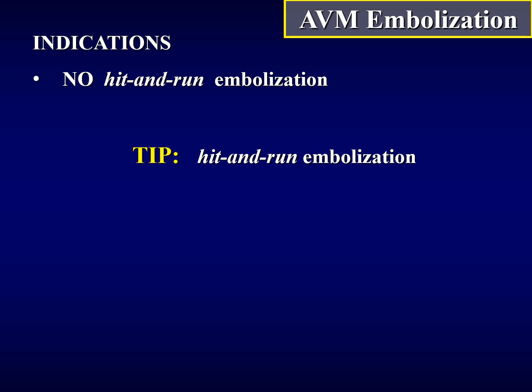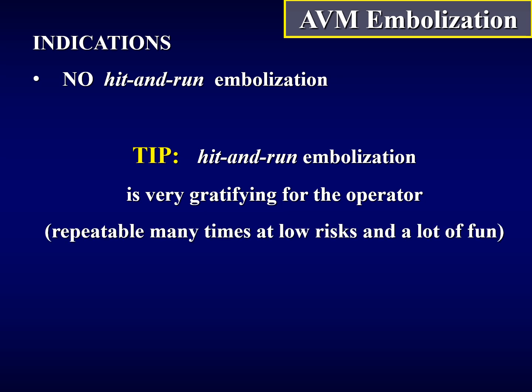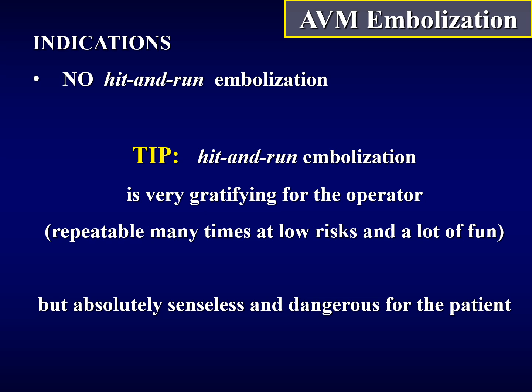Tip: hit and run embolization is very gratifying for the operator because it's repeatable many times, it's at low risk, and it's a lot of fun. But it's absolutely senseless and dangerous for the patient. And unfortunately, it's what is mostly done in the world today by our colleagues.